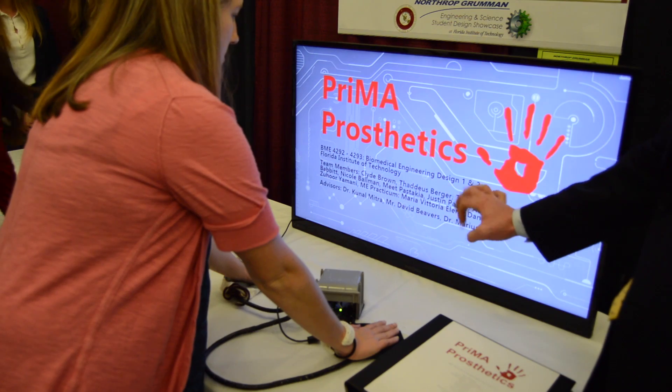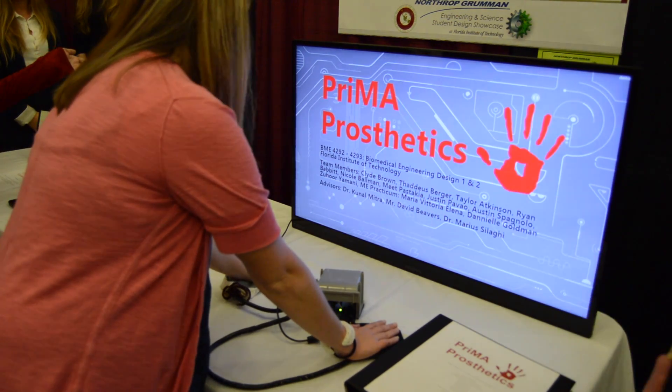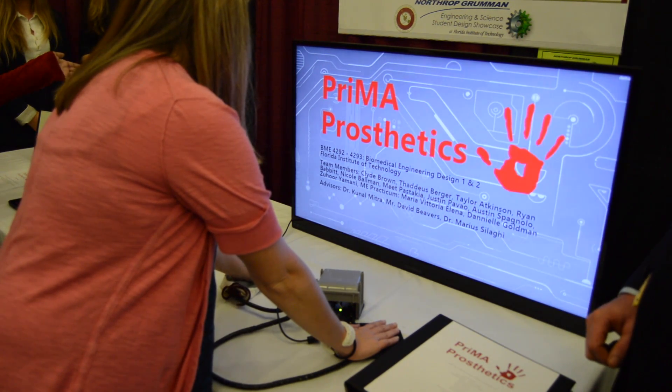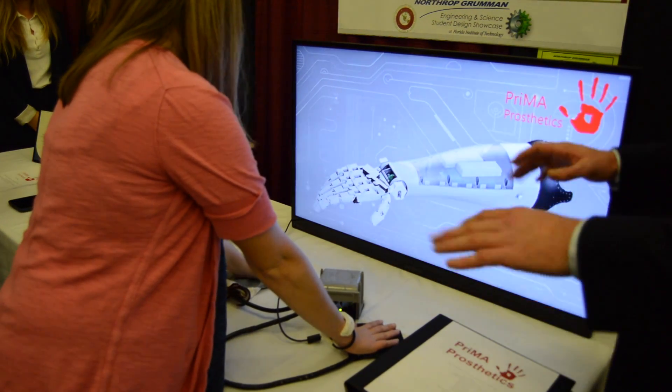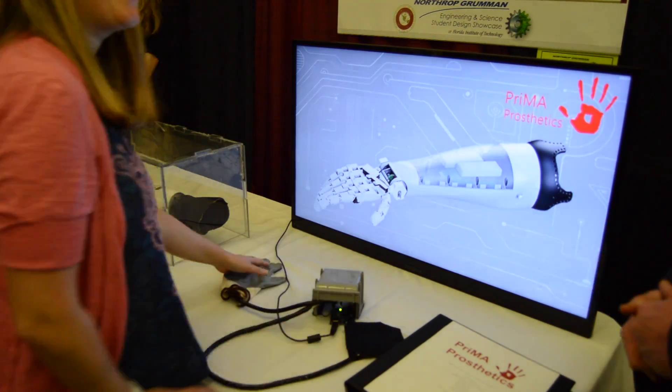Our hand also offers touch sensing, provided through force resistors in each of the fingertips and vibrating motors in the neoprene sleeve the user wears. Every time a finger touches an object, it sends a signal to the corresponding vibrating motor letting them know they're touching that object — the harder they press, the harder the motor vibrates — essentially giving them a sense of touch back.